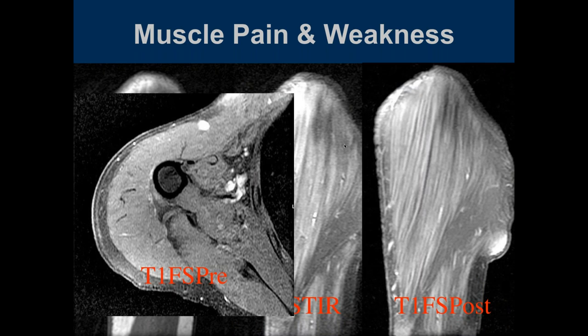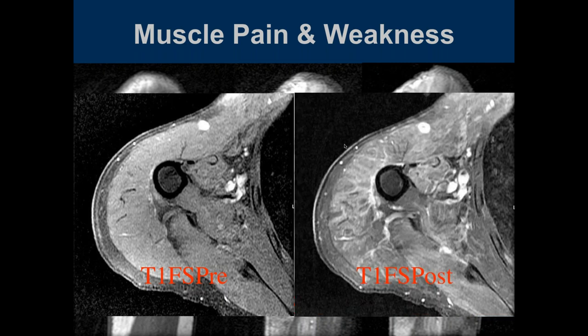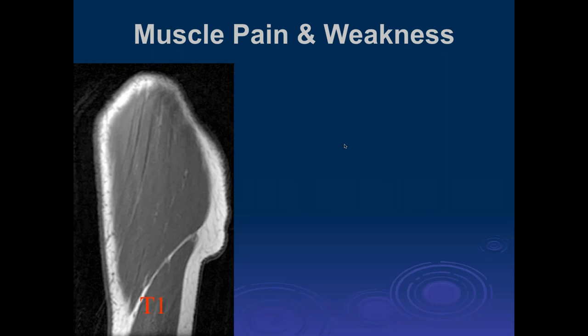Okay, now there's a lot of muscle edema and some enhancement on the post contrast, and the myopathy, mainly the deltoid. Here's a T1. Are there different times? These are all the same time. Same time. Yeah, same study.